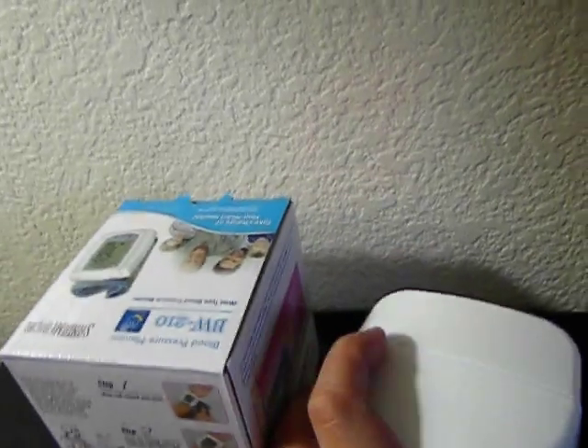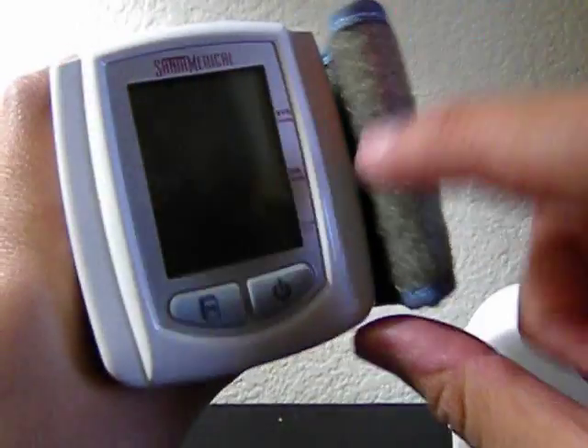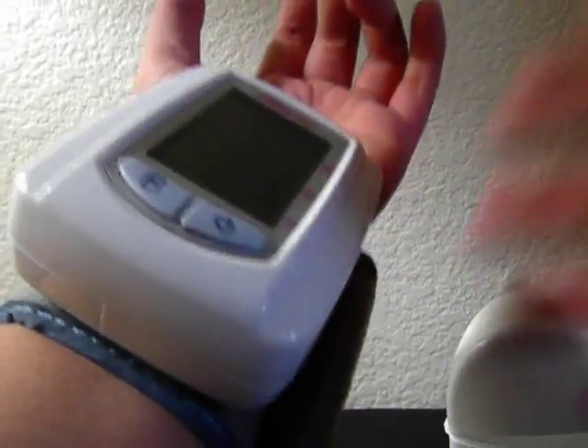So I'll show you how to use the blood pressure monitor. Let's open it up. This is the blood pressure monitor. There's an on button and this is a memory button. So what I'll do is wrap it around my wrist and then just close it.